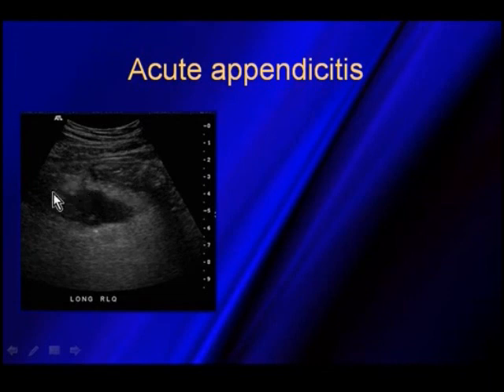So when I started scanning this patient with a high-frequency linear array, I noticed that I just saw this fuzziness deep in the image, and then, as I mentioned earlier, what I like to do when I switch to a lower frequency transducer is to actually go to a curved array, because you get a wider field of view. You can see there's just this big fluid collection and a lot of edema going on.